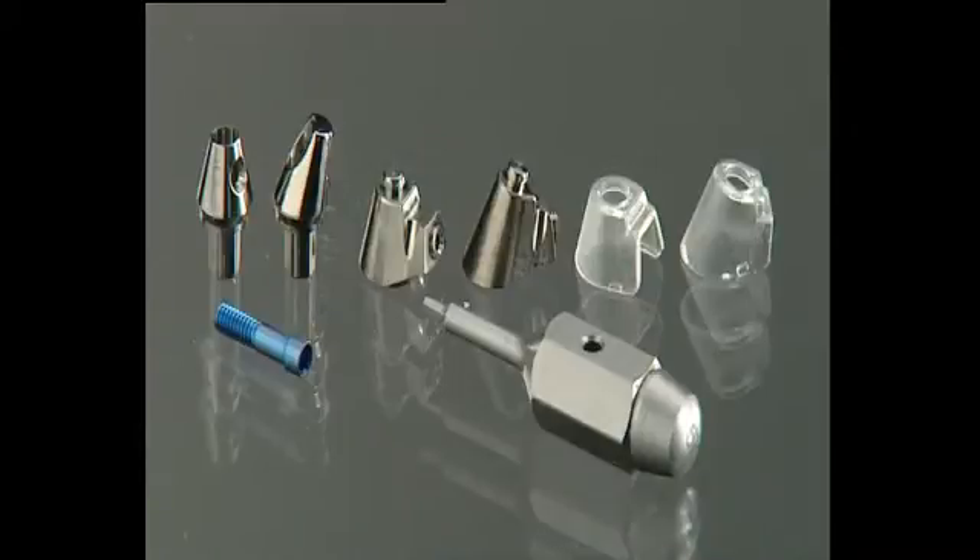A UV-E universal connector is used so that the bridge is operator-removable. The UV-E abutments are screwed on and checked in a parallelometer. Straight or 15-degree angle abutments are available.